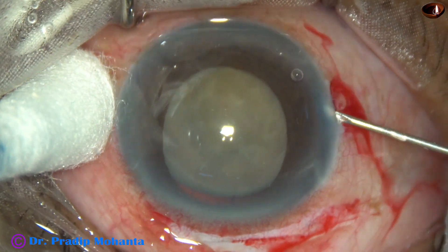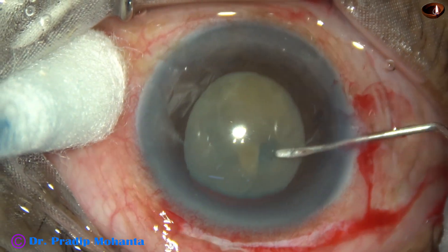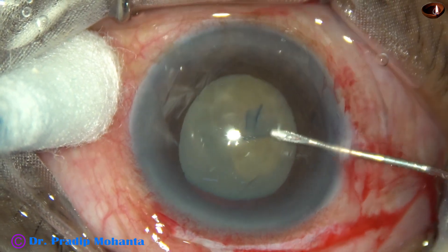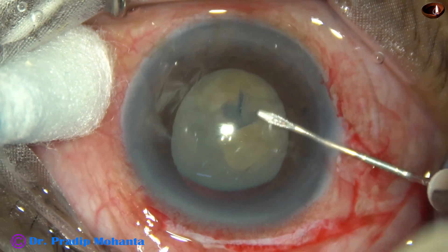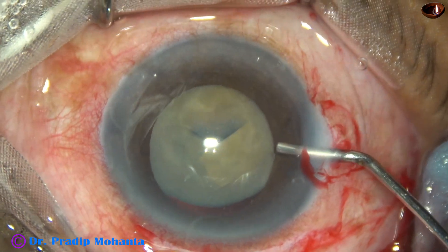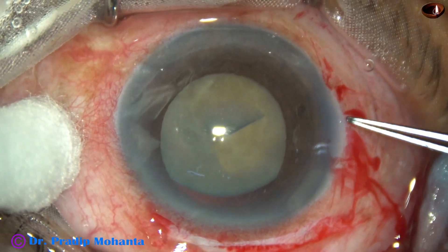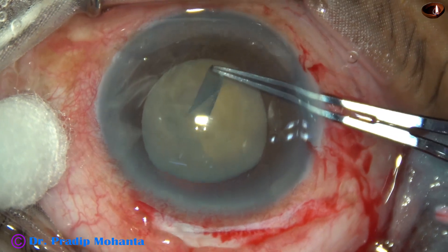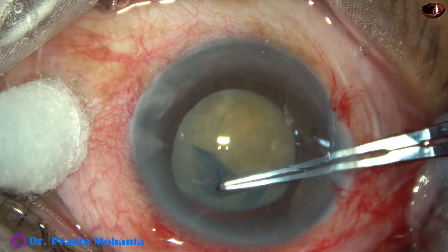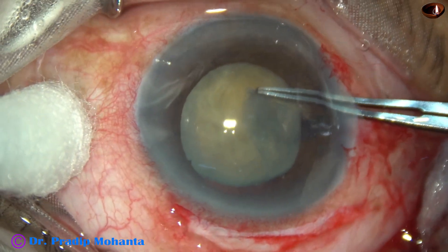To do the rhexis, I take help of a 26 gauge bent needle. We can see some red reflex from twelve o'clock. This is the capsular tag raised by the needle. I inject some more viscoelastic, and then use the utrata forceps to complete the rhexis. The rhexis is done gently.